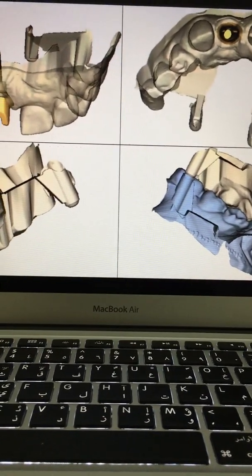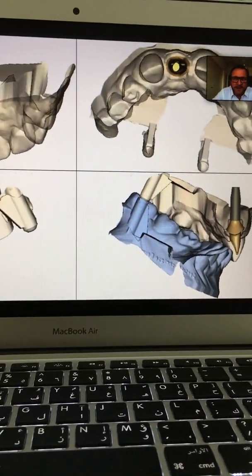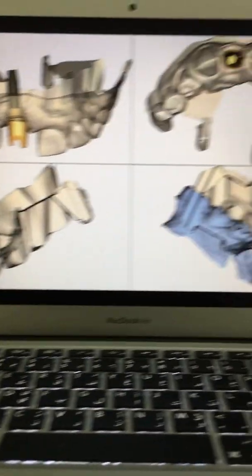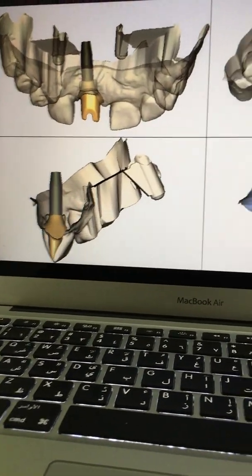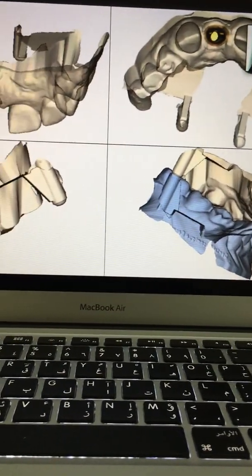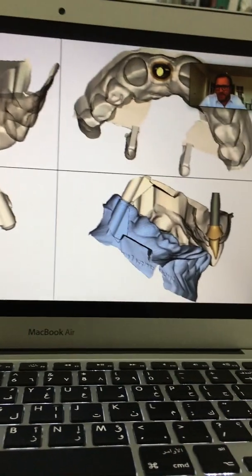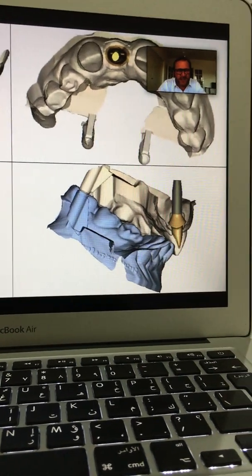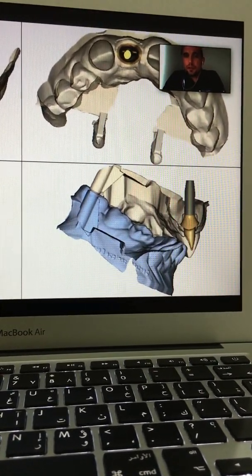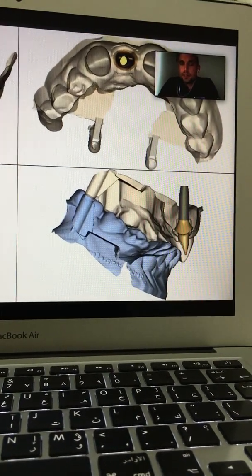Yeah. So the first one is from Mr. Shamsuddin. What is your formula for the bridge connector area size between crown contact and crown pontic contact, especially in low crown height cases in Asian patients? Yeah, I'm not sure I have really understood the question. It's about, well, what kind of parameter I need to have the good result? Can you? I would say, so what is the formula for a bridge connector area size between crown and crown contact and crown and pontic contact?